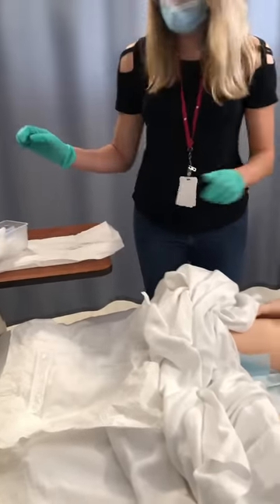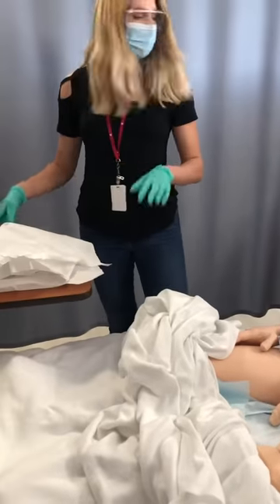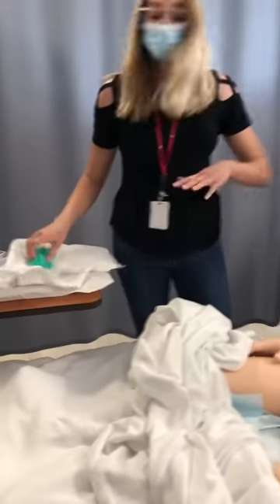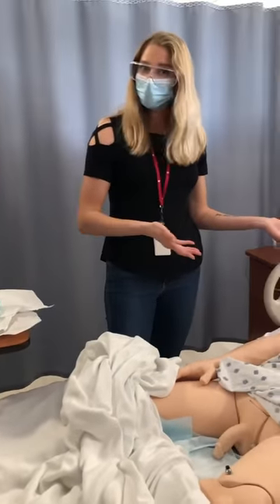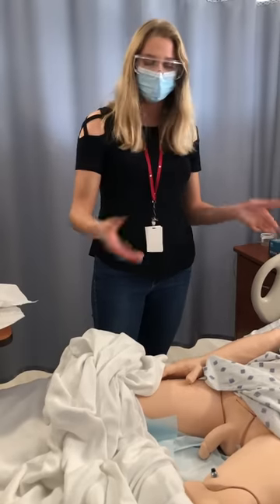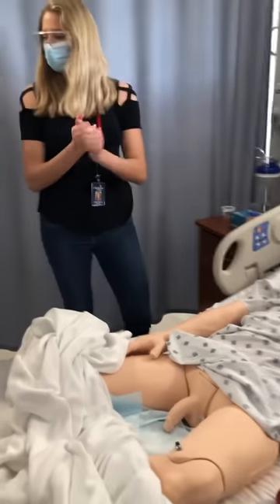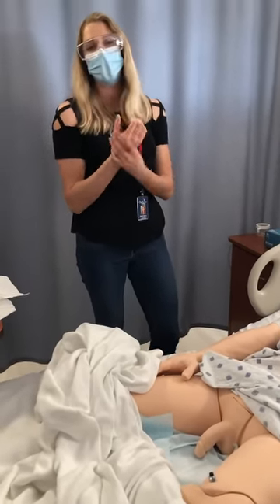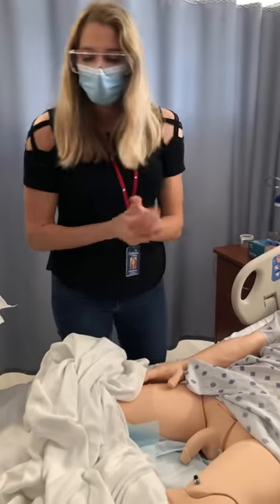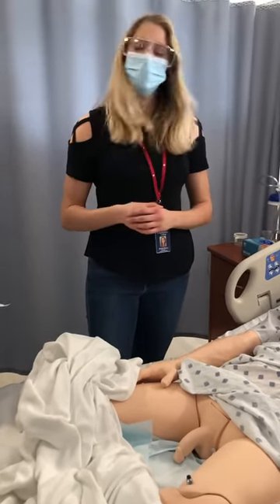That's a relief. Thanks, Abby. You girls, you have to do so much. I will clean up my equipment. At this time, I would also cleanse my patient again, but for the purpose of this demonstration I will not — in actual catheter care, I would cleanse after the procedure. And now I am going to check the urine. What I am going to look at is the volume, the coloration, whether there is any sediment in the urine, and also how my patient reacted to the procedure in general.